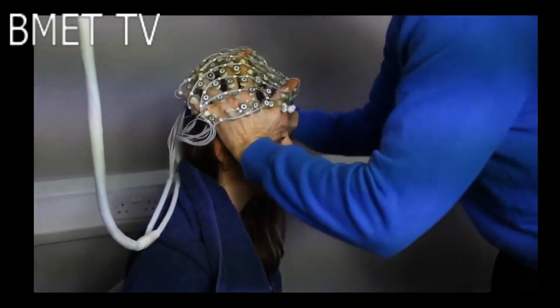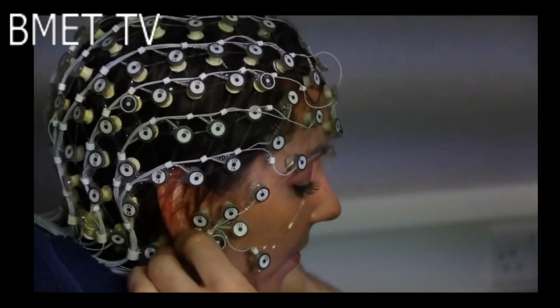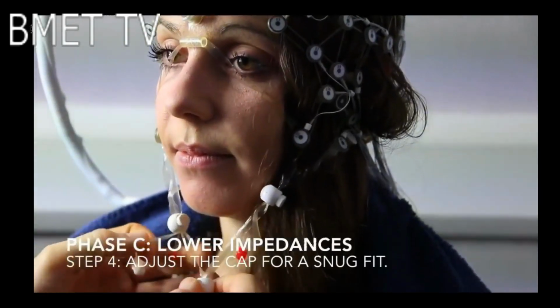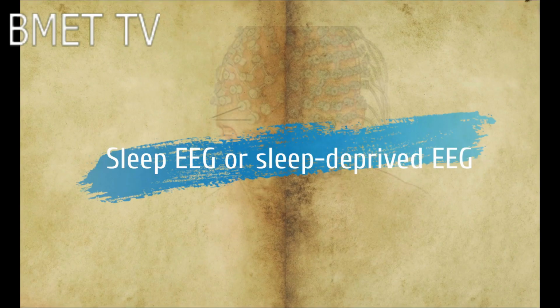Let's start with routine EEG. A routine EEG recording lasts for about 20 to 40 minutes. During the test, you'll be asked to rest quietly and open or close your eyes from time to time. In most cases, you'll be asked to breathe in and out deeply, called hyperventilation, for a few minutes. At the end of the procedure, a flashing light may be placed nearby to see if this affects your brain activity.